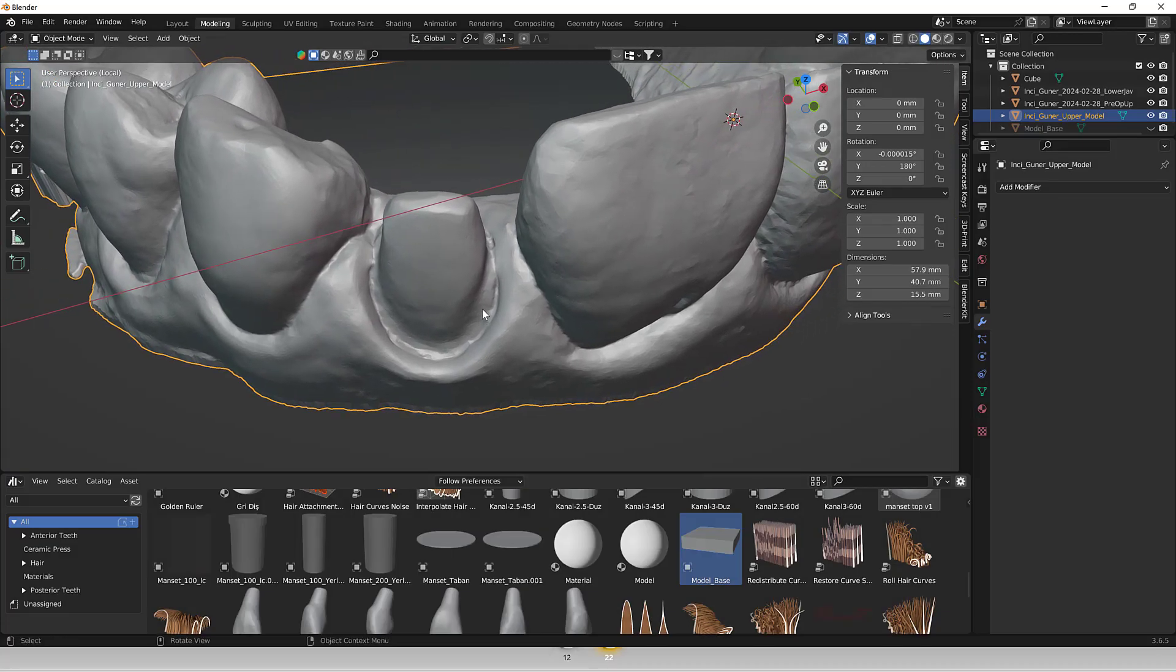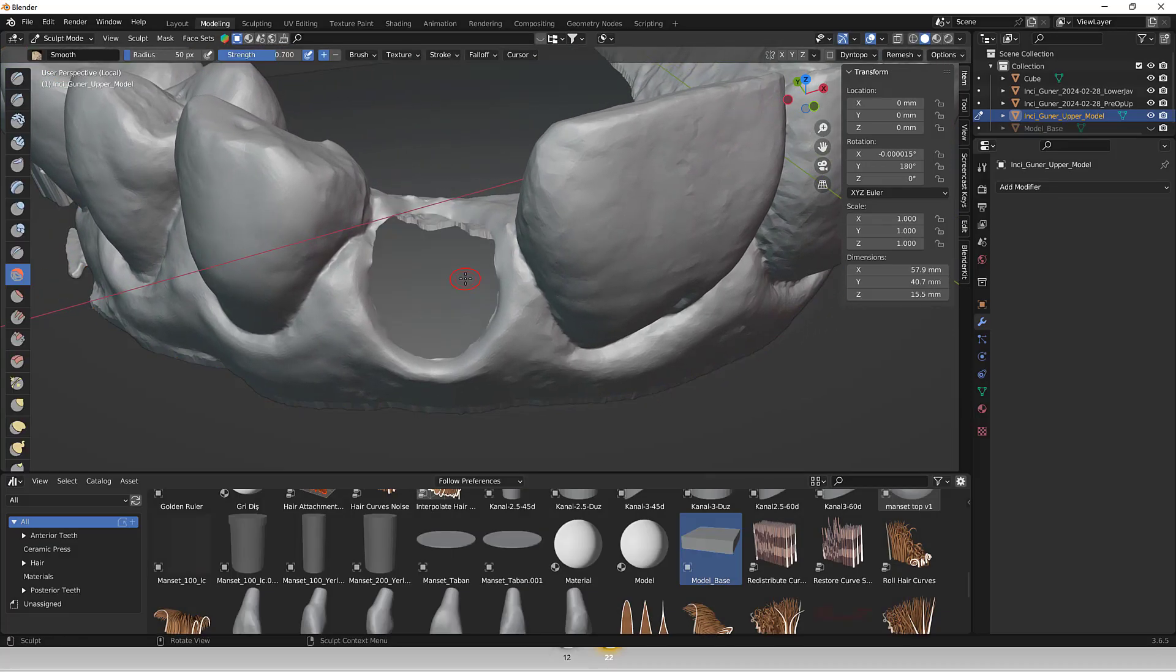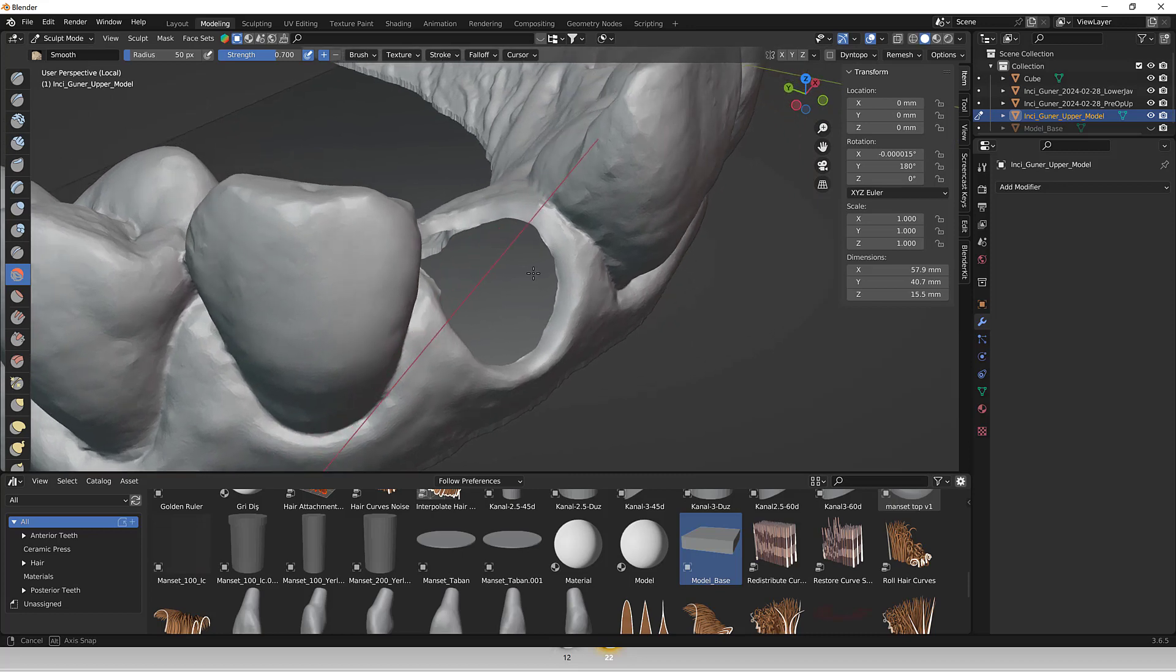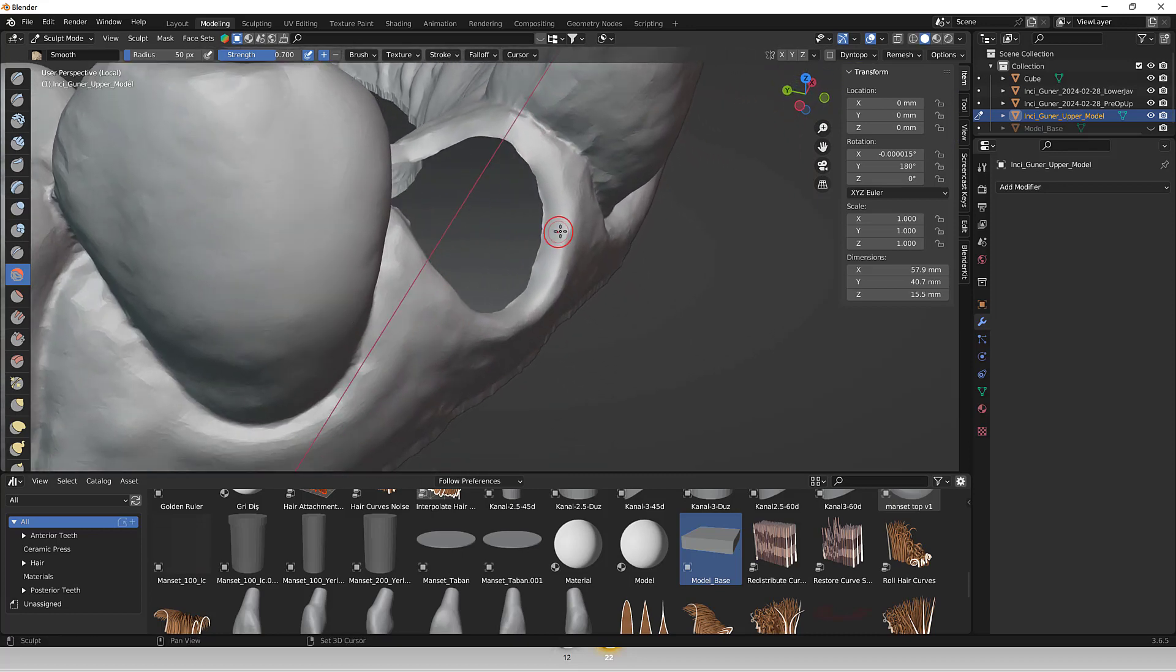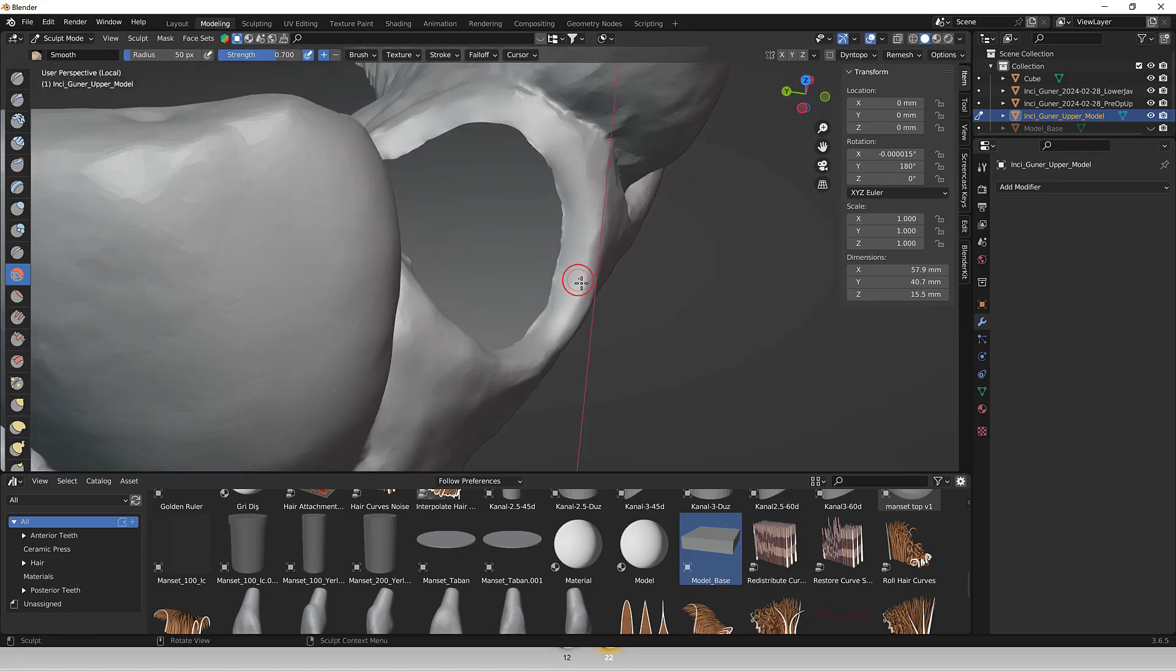Hi, I'm Dr. Osman. Blender software offers several advantages for editing STL models, especially for dental applications.